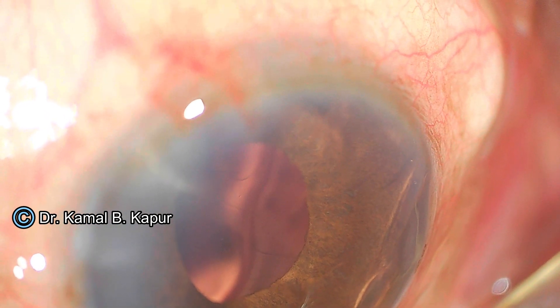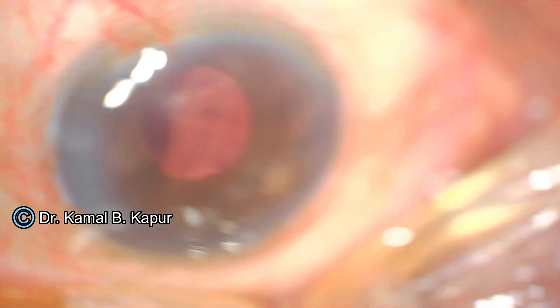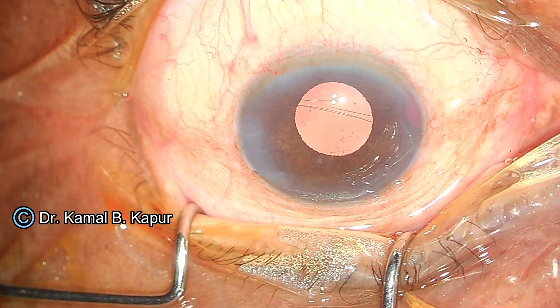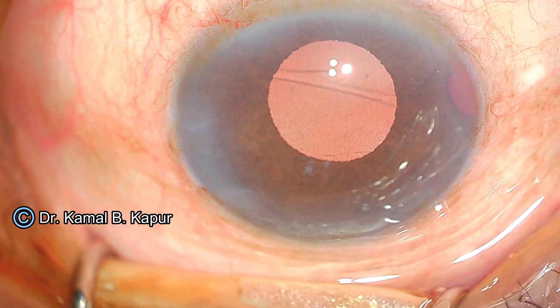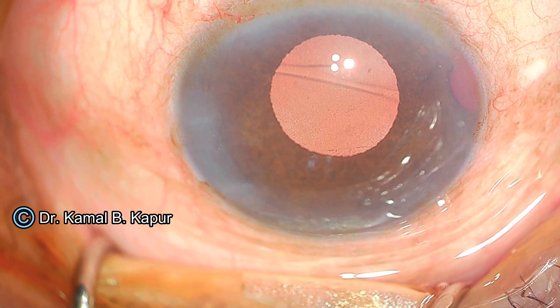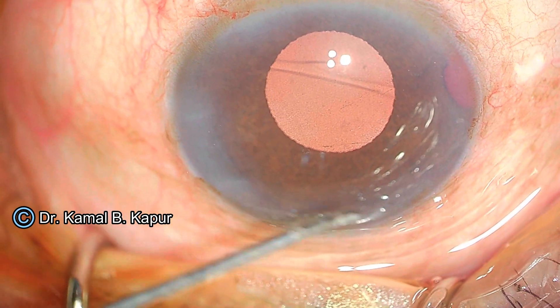Once the goniotomy is complete, keep the viscoelastic instilled in the eye for some time. This ensures that the slight ooze of blood from the trabecular meshwork is controlled and allows enough time for the blood to clot. I normally wait around two minutes or more; as you can see, there is a slight amount of ooze in that area.